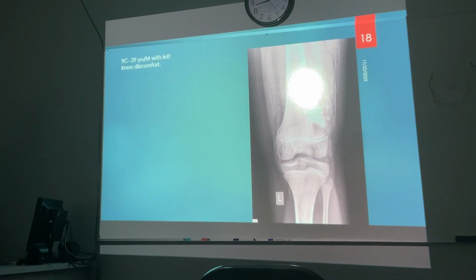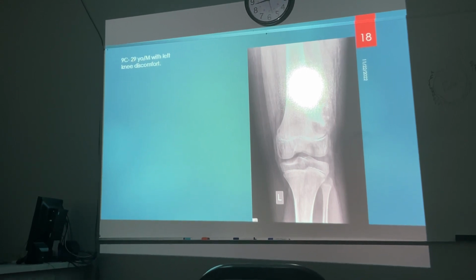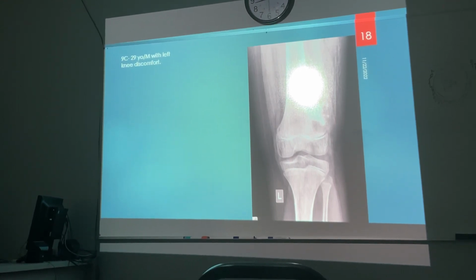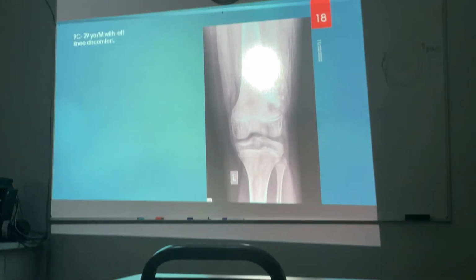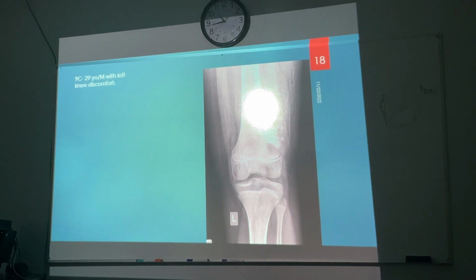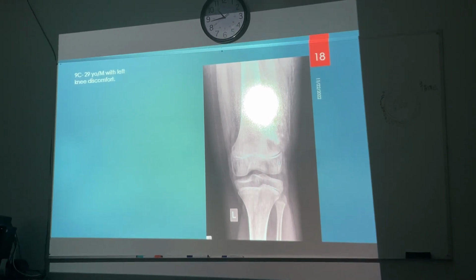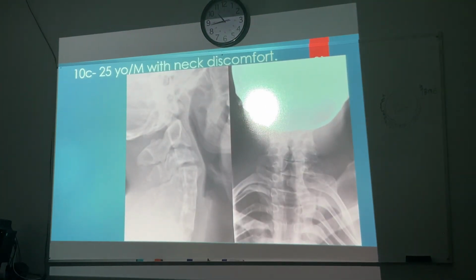This is supposed to be 19, okay? Growth plates, density, but it's both overlying the cortex and the soft tissue, but it's dense. It can't be Ewing's, it's radiodense, so it's osteosarcoma until proven otherwise. I know you didn't have this.